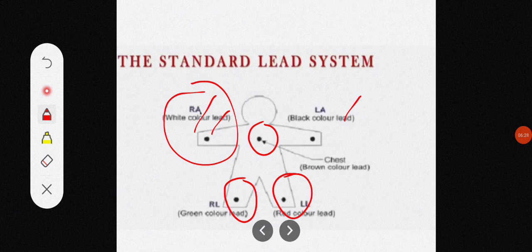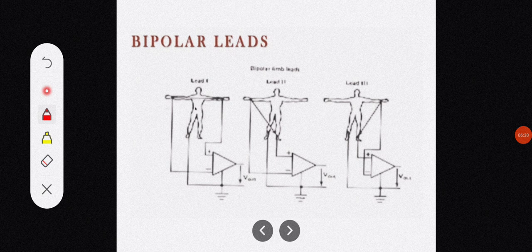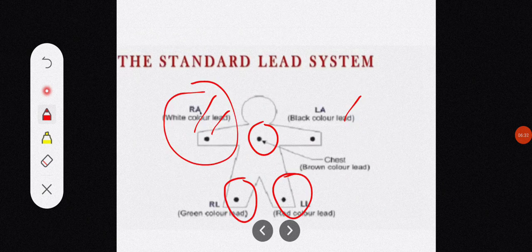So both the arms were used for this purpose, in the sense that both the electrodes were placed on the arms, as well as the electrode that was placed on the left leg. The left leg was chosen because it terminates vertically below the heart. So the early electrocardiograph machines thus used 3 electrodes, of which only 2 were used at one time.